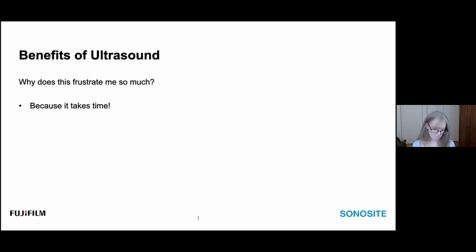It takes time. There are actual suggestions out there that it could take up to 500 cannulations in a row before you become proficient at using the ultrasound for guided cannulation. That seems like a lot, and it is. But that doesn't mean that through that journey, you're not increasing proficiency, increasing your confidence, decreasing miscannulations. It's frustrating.